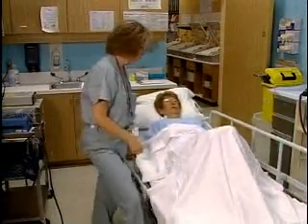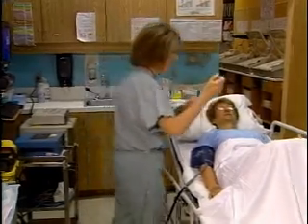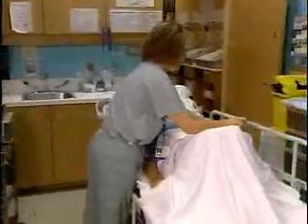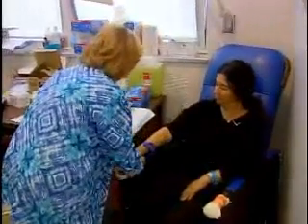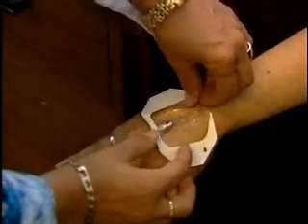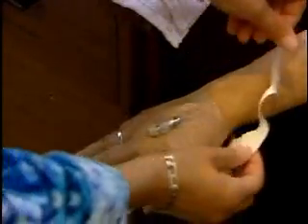In the treatment room, we ask the patient to sit on the stretcher. We will put a finger probe on their finger, which measures their oxygen level and their pulse, and a blood pressure cuff on their arm. If the patient is going to have intravenous sedation, then an intravenous cannula is placed — a very fine tube that goes into one of the veins, usually in the arm or the back of the hand — to allow sedation to be given during the procedure.